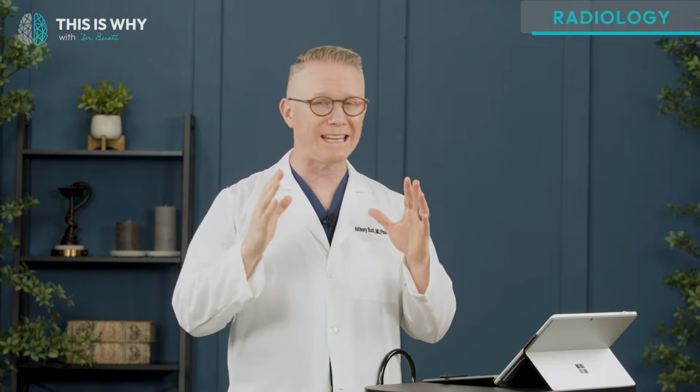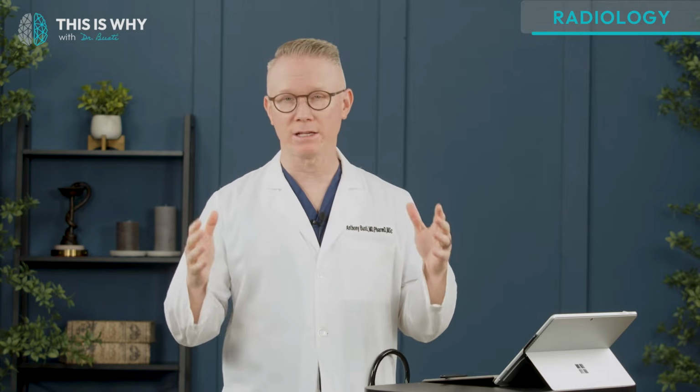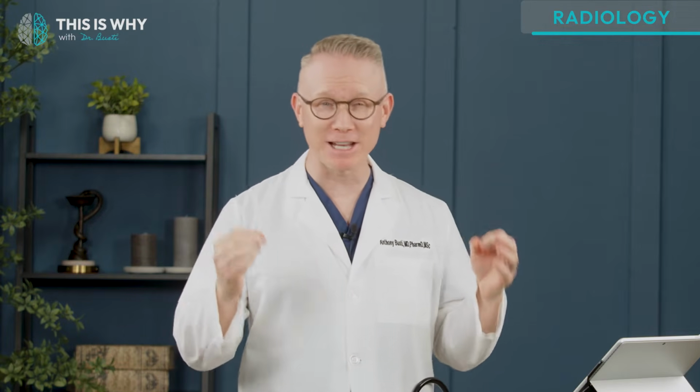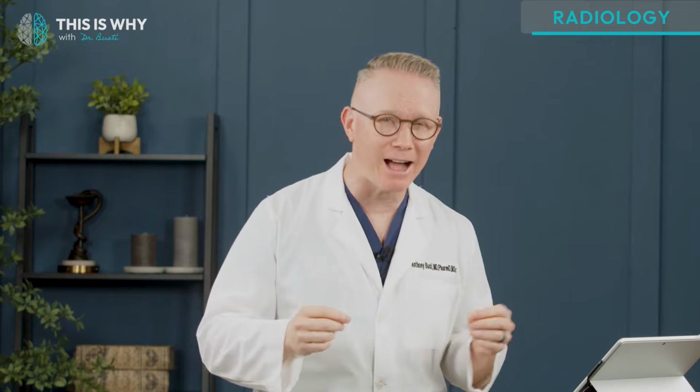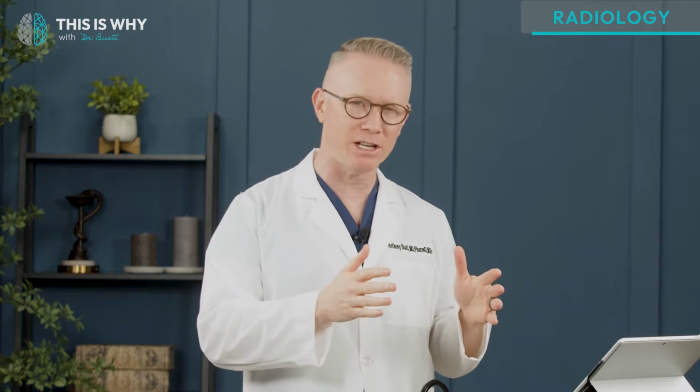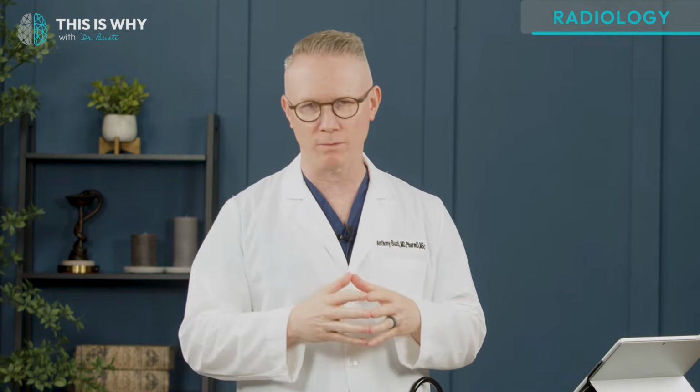Okay, let's get started. As in all of my medical education lectures, we need to understand the why. So our first question is, why does the image projection even matter? Well, first, because the portable chest x-ray is one of the most common chest x-ray images we get in the hospital, and that projection is an anterior, posterior, or AP view.